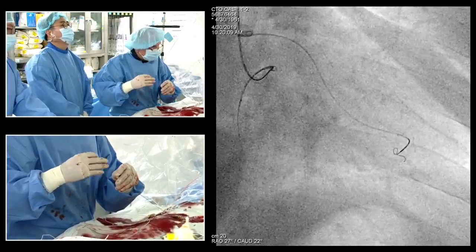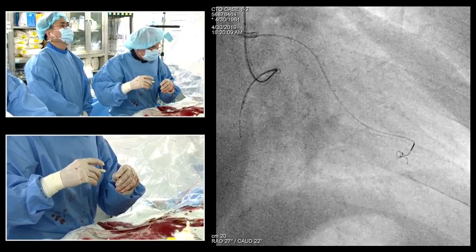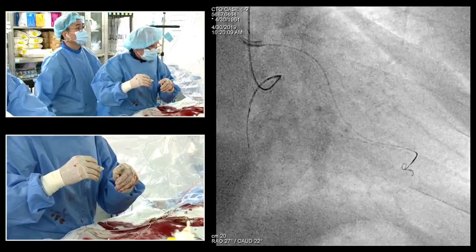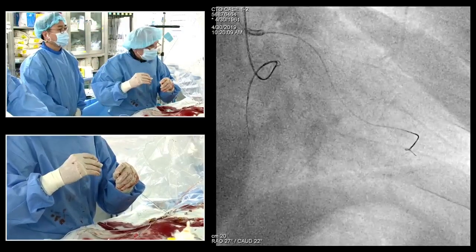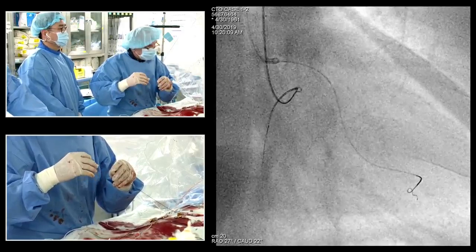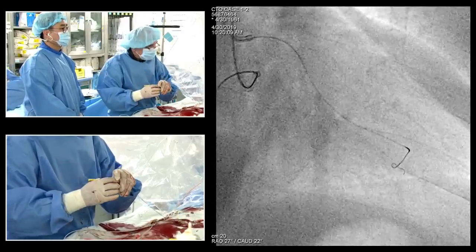Of course, a loop is a little bit dangerous because you can flip over and make a knot there. Let's wait for maybe the wire takes the course. Of course, we need to be careful, especially in an outside lab where we don't know. Doesn't make much progress here.